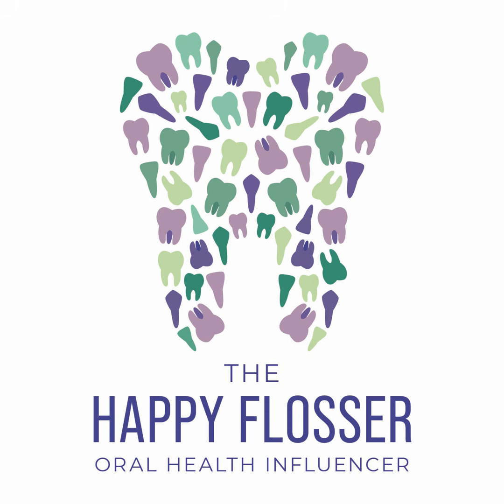The ADA guidelines suggest that we take a full mouth series of radiographs between 1 to 5 years based on the patient's risk. Bite wing radiographs every 6 months to 3 years, depending on the patient's risk, and a Panorex every 1 to 5 years, depending on the patient's risk.